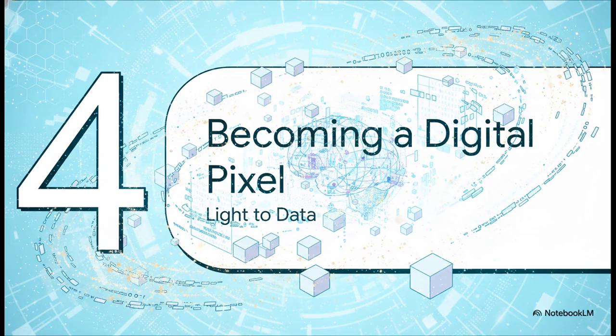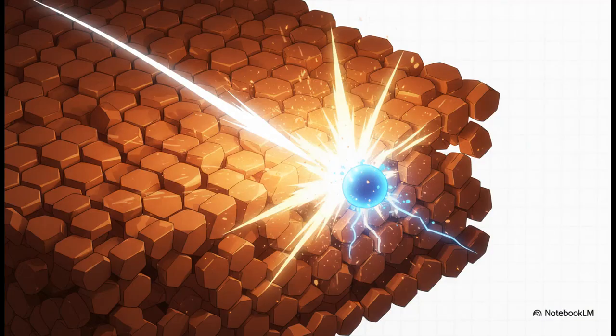And that brings us to the grand finale, the final, most technologically advanced part of our hero's journey, the incredible transformation from a particle of light into a piece of digital data. The instant our photon strikes the sensor, it hits a special layer, a photoconductor, and this layer does one thing perfectly. It converts light energy back into electricity.